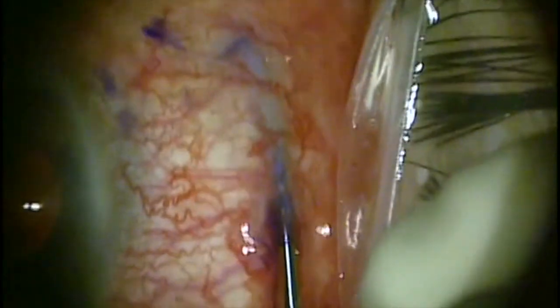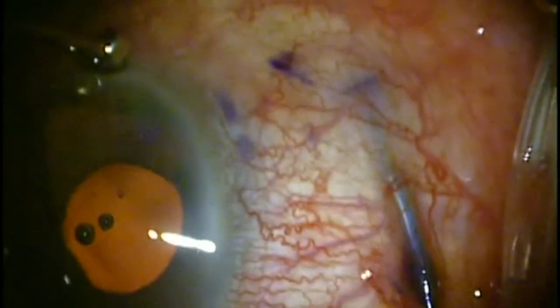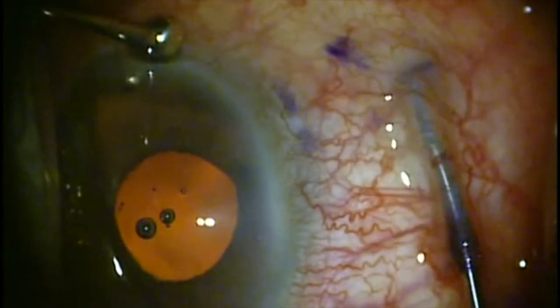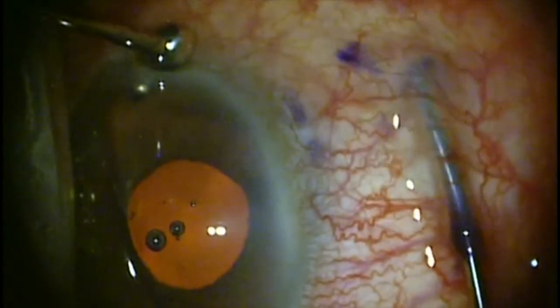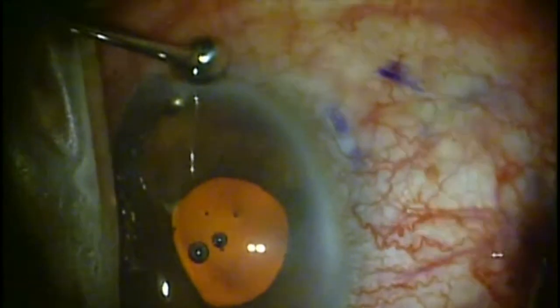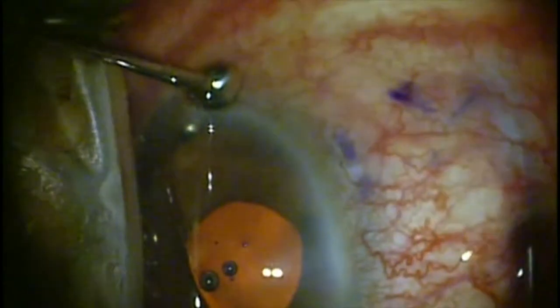It's important that you don't press the Zen posteriorly onto the sclera and pull it back out of the sclera — it can actually be dislodged or damaged. So just take care not to damage the Zen Gel while you're dissecting.